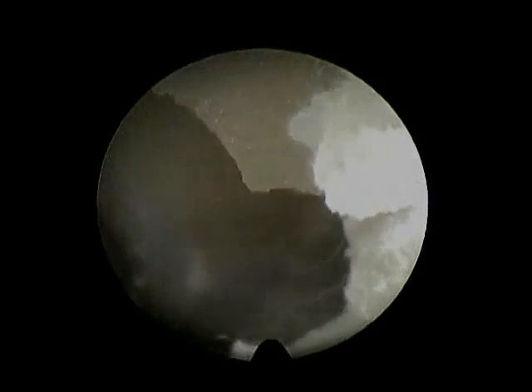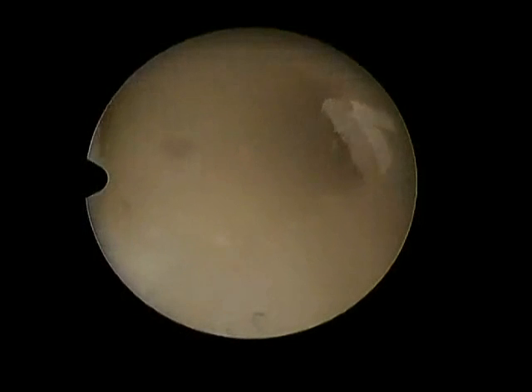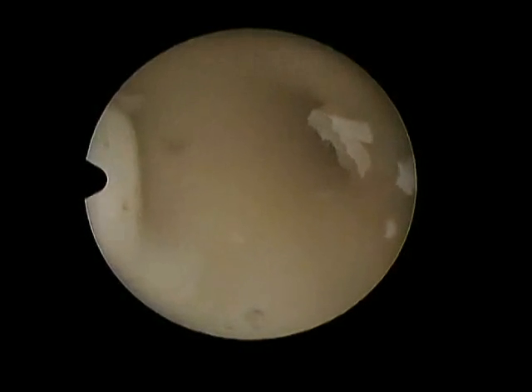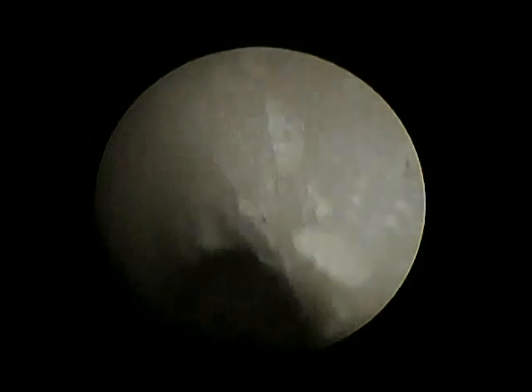So we go to the fundus. We see here a little polyp. Look at the triangle. We put it at 9, and we see the left ostium at 3 with polyps too here, yes. So we visualized both ostia. Now we remove the hysteroscope very slowly.